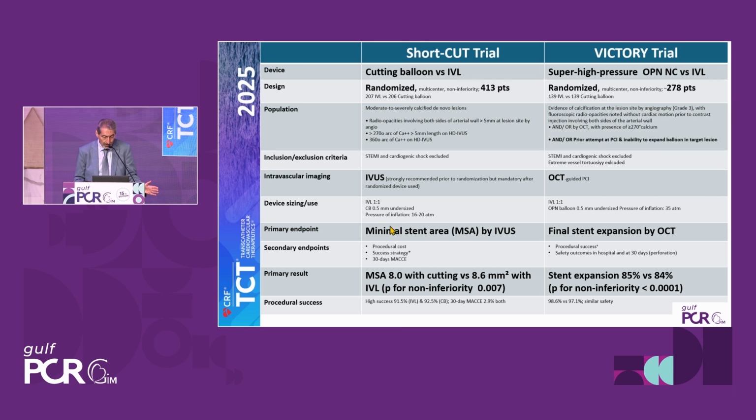So the endpoint is not a clinical endpoint, it's a mechanistic endpoint of stent area or final stent expansion, both assessed with intravascular ultrasound or optical coherence tomography. You have the impression that these are imaging-based studies.